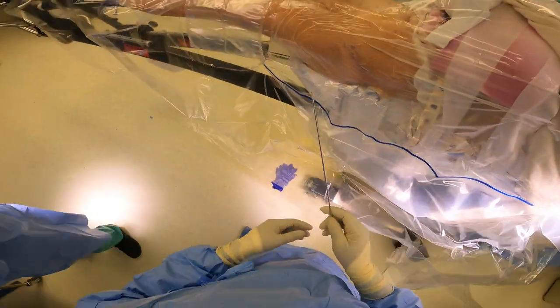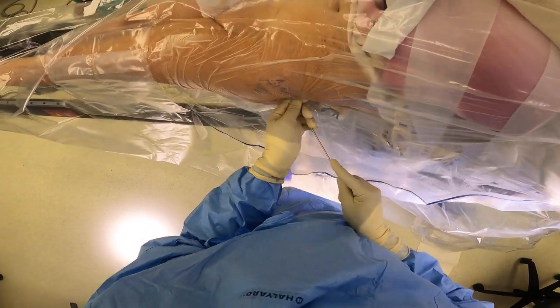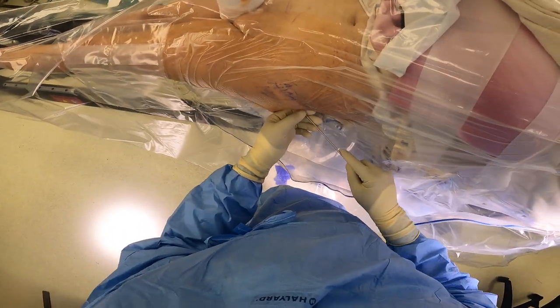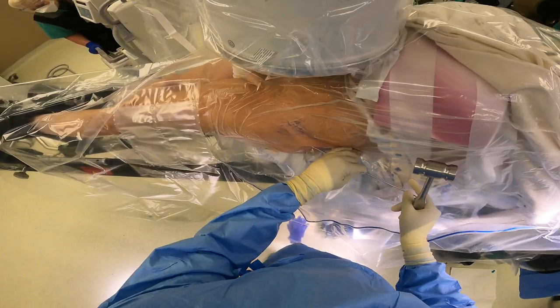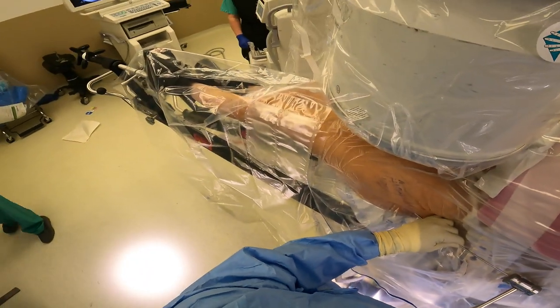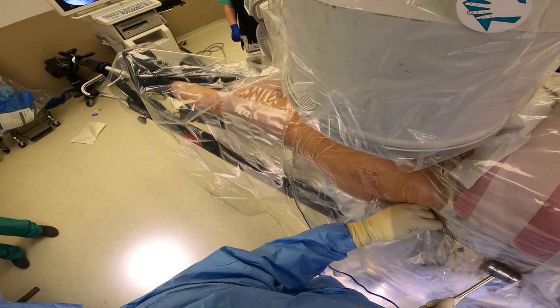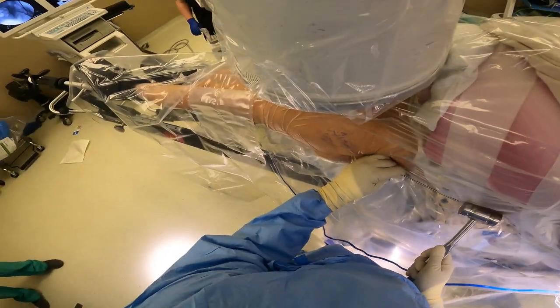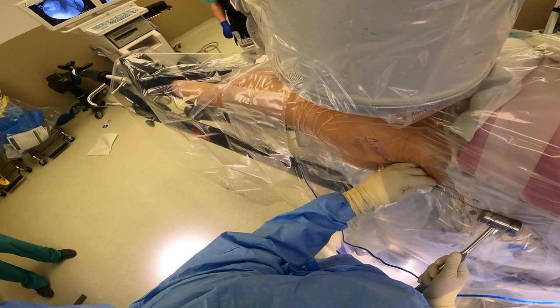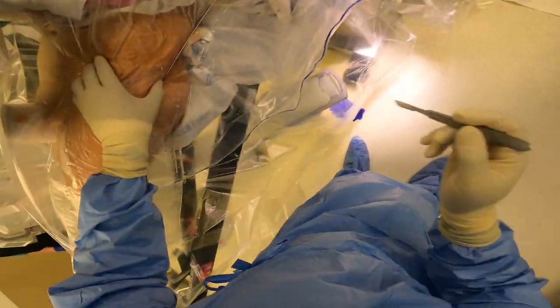This is a pin that we place into the bone — this is usually how I start. Then what I'm going to do is make an incision over this pin right over the skin, and then we're going to drill the path for the nail. Most of these hip fractures are treated with intramedullary nails — these are nails that go on the inside of the bone to stabilize the fracture until it heals. I'm checking the x-ray and making sure that this pin is in a good position.